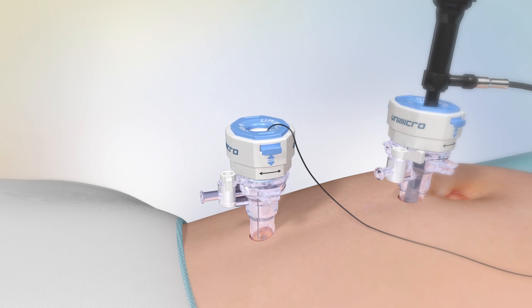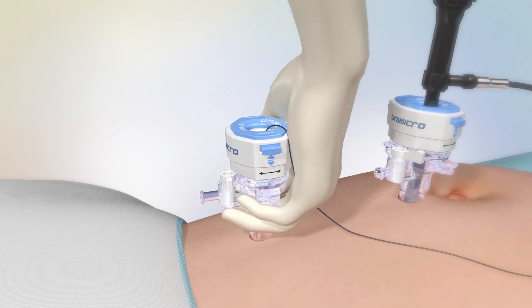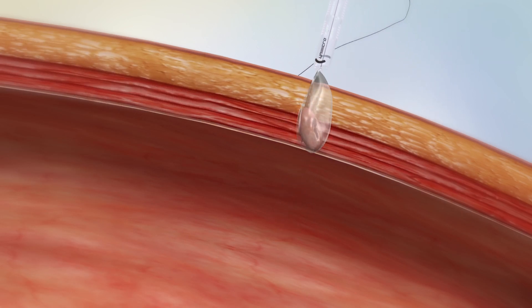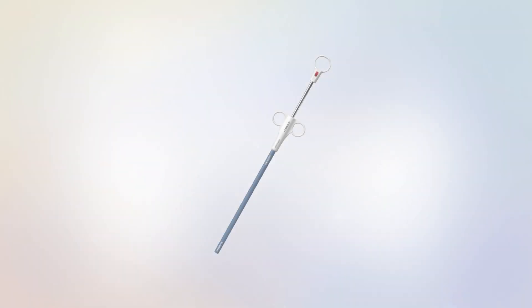The new auto retrieval endo bag will not occupy the trocar, and you can take out the endo bag and the trocar together when the operation is finished.